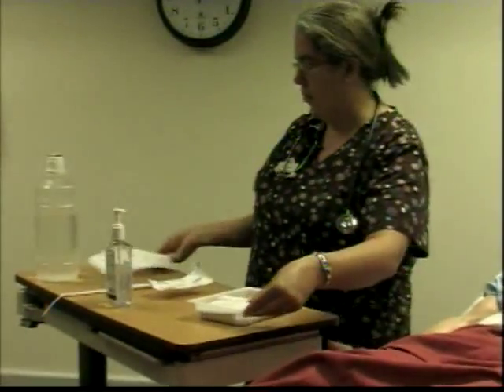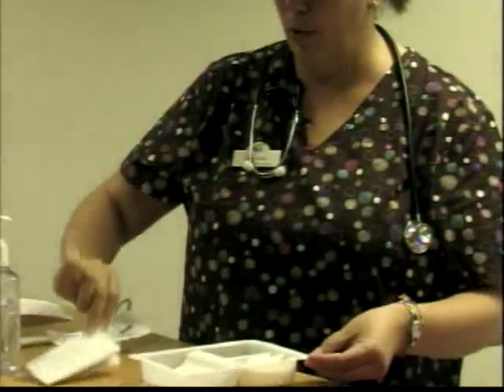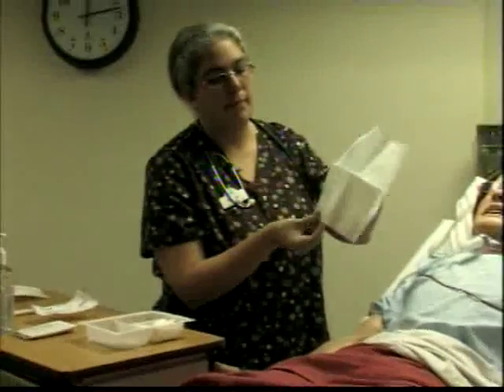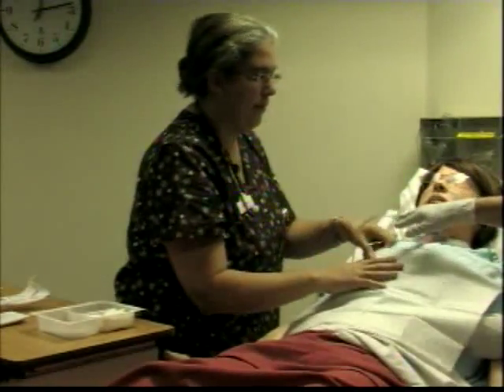I'm going to show you what's in here. So you see, you have a set of gloves. That's what we're going to use. Then you have a little towel for your client, so you will remove this. It has a shiny part down, so the patient will have it. If you have any spill or anything like that, then you'll have it in here for your client.